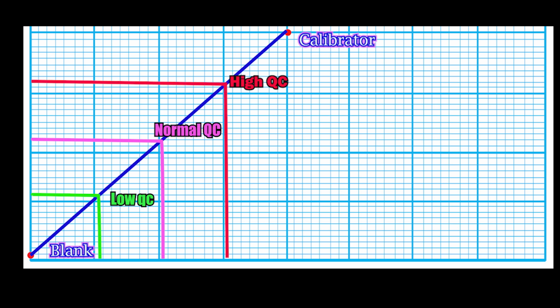The standard and calibrators are used for calibration of an analyte in an instrument. The difference is the matrix present between them. Standards, calibrators and the control materials can be used as quality control to check the calibration and the instrument status. All three of them have a known amount of analyte in solutions. The standard and the calibrators also can be used as a QC material.